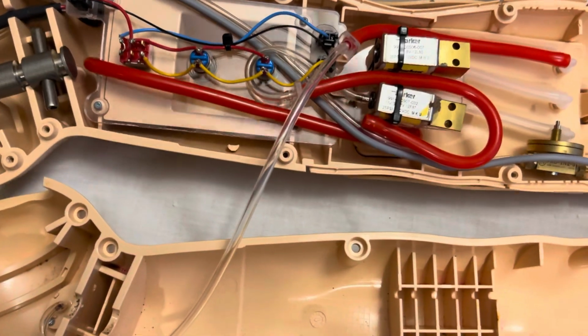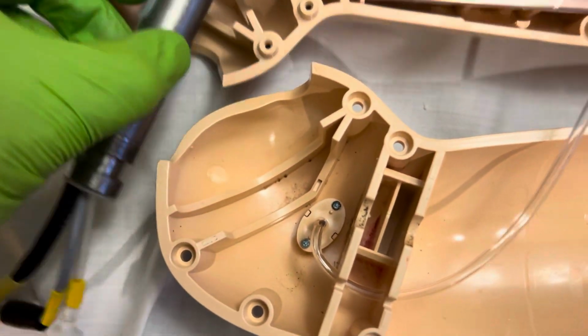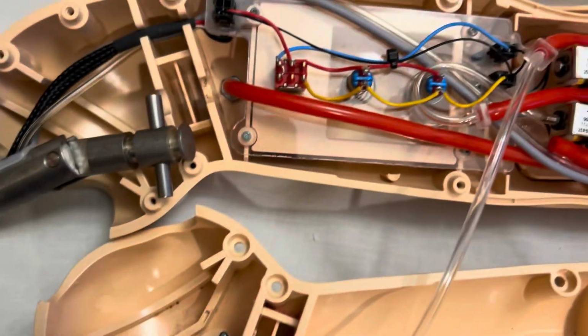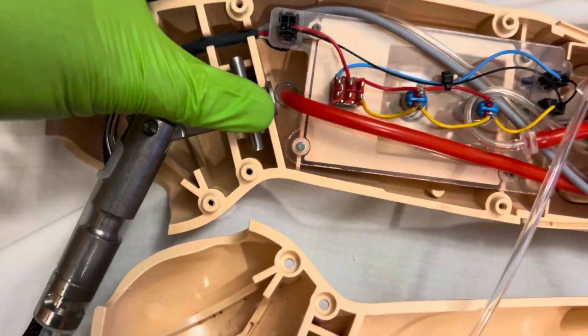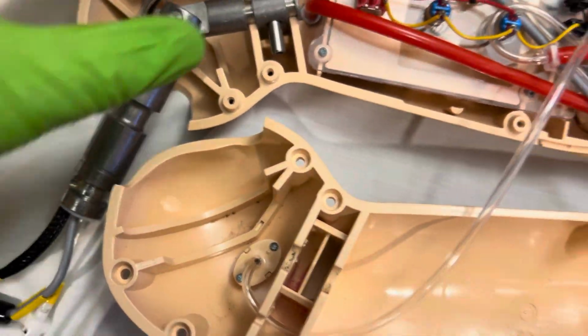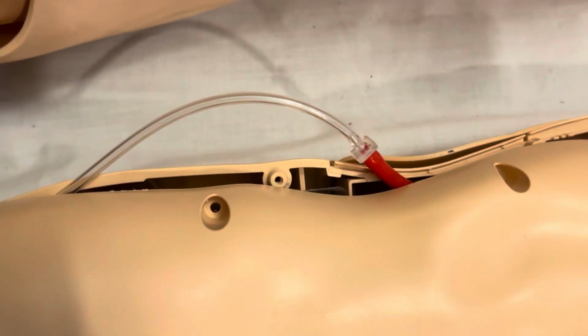So, all right. Another thing is the point where the shoulder rotates, make sure that's seated in there, because this can pop out instead of alongside here. There we go. So make sure it's in that area, so that it rotates properly. Now we're going to roll the casing back over, and I'm going to double check to make sure that none of my hoses or any of that stuff are sticking out like that.